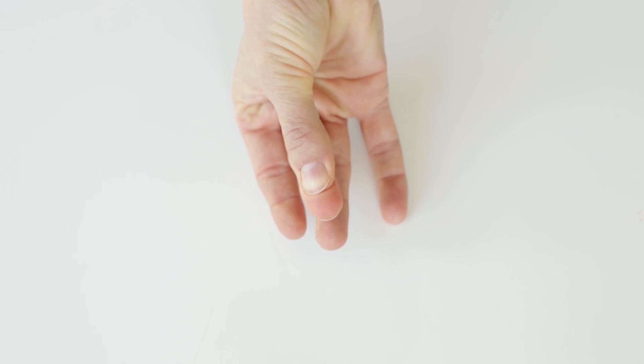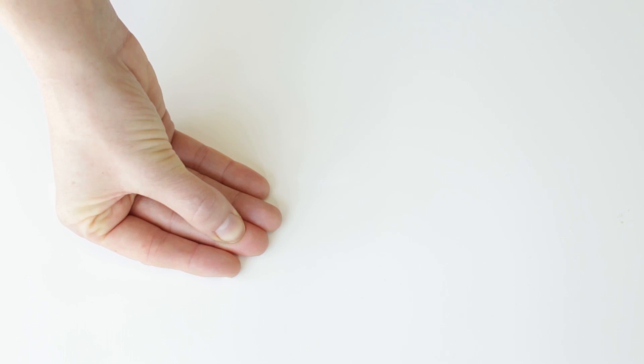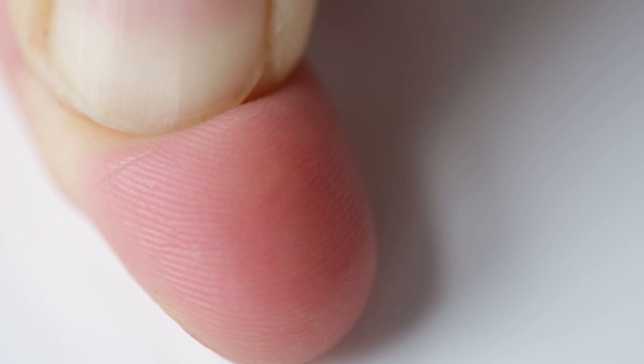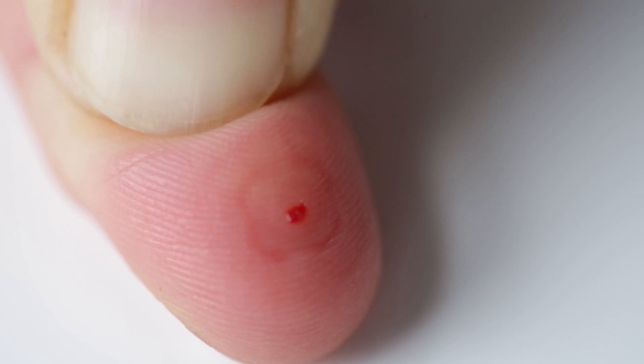Press the top of your finger with your thumb so that the tip of your finger turns pink. With your thumb still in place, press the lancet firmly against the middle of the tip of your finger and push hard. You will feel a tiny prick.